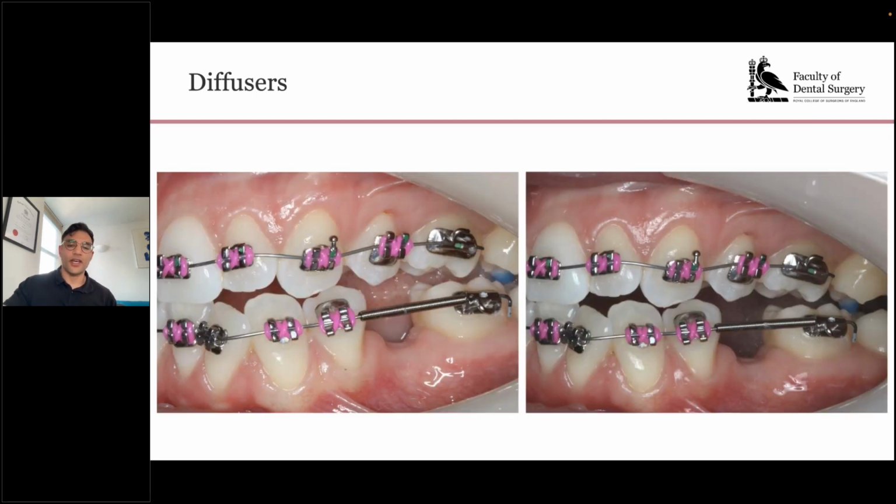Well, on the left, you've got a photograph taken without a diffuser. On the right, you've got one taken with. And on the right, the image looks drier, and it can, for some people, appear to have a better quality. And it looks drier because saliva reflects light. And if you attenuate those reflections, things appear drier. So some people prefer that look, and that's what diffusers do.